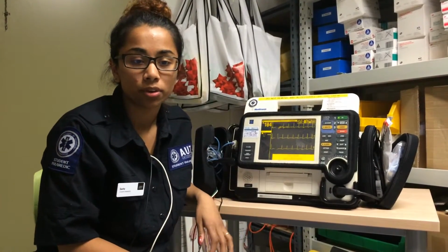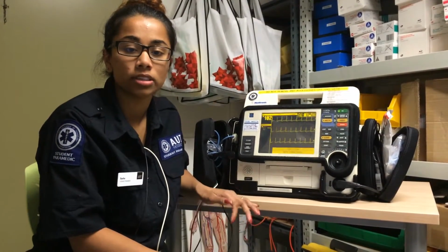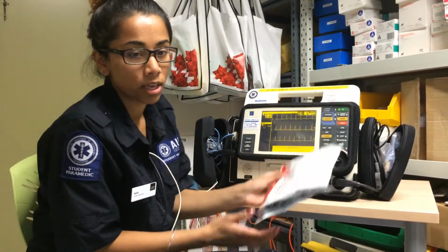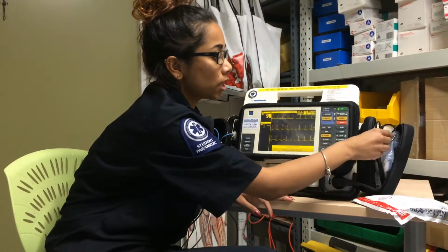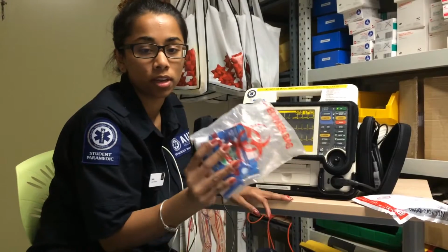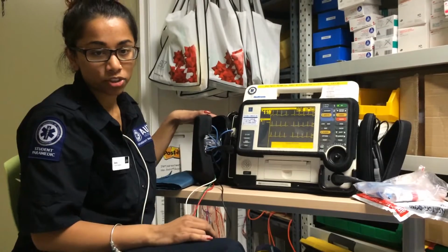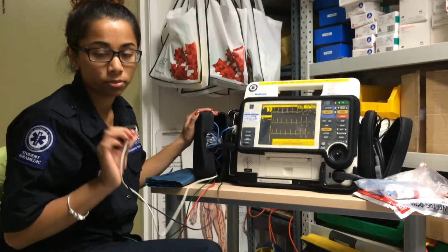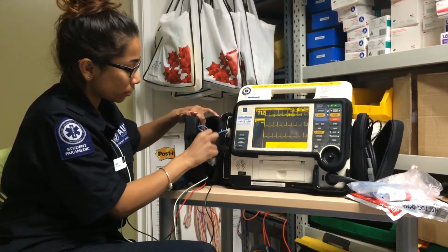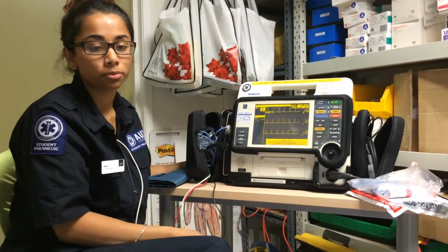So also after you've done that, because when you turn the LifePak 12 on, it will go straight into defib pads mode. So in the left hand pouch you will find your defib pads. Here you'll also find your 12 lead ECG cables, and there will also be a bag that has a GTN, aspirin and a razor if you have a hairy patient. And also in the right hand pouch you will find your normal ECG leads, which are attached to me, your SpO2 probe, which is here, and your ETCO2 cable as well, your consumable, sorry.